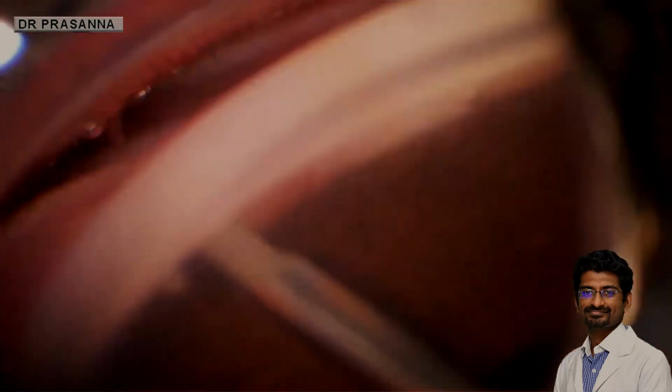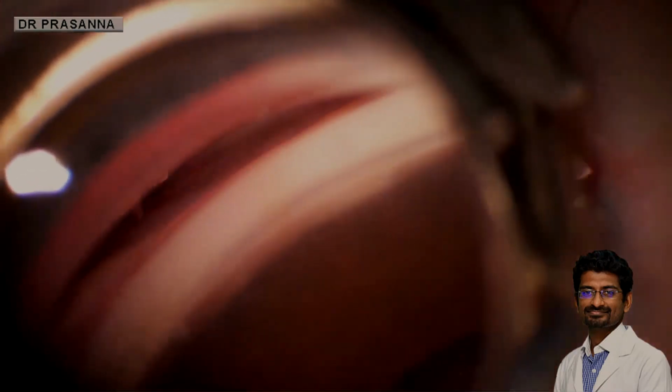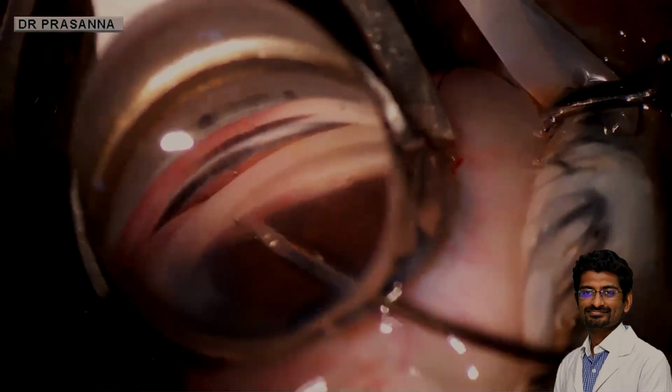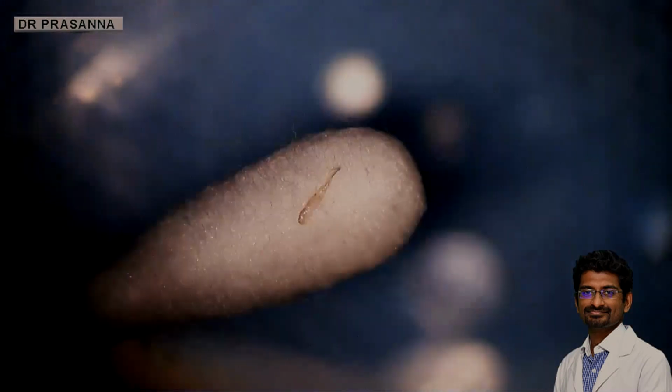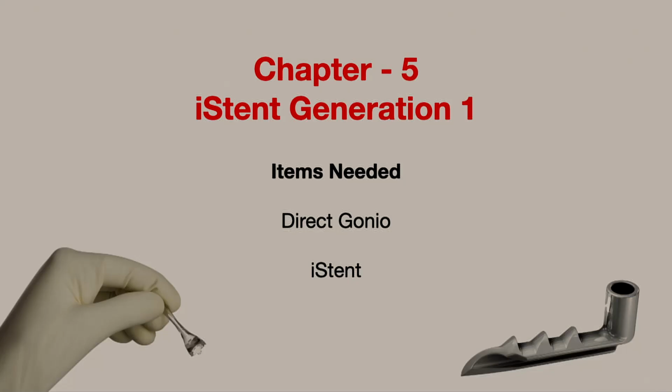Again, this is another novel technique that I use when you want to reach the more periphery. Just give a nick, and I think I learned this technique from some of my colleagues on the dais who have a lot of videos. You can always use ILM peeling forceps, then remove the trabecular meshwork which is overhanging, and you can keep it on a sponge and then demonstrate it.